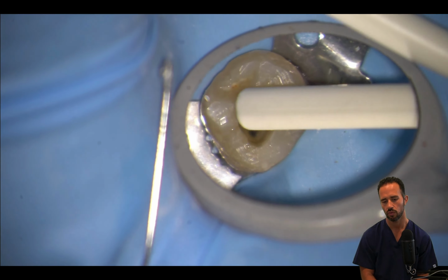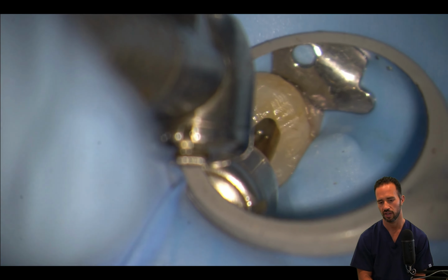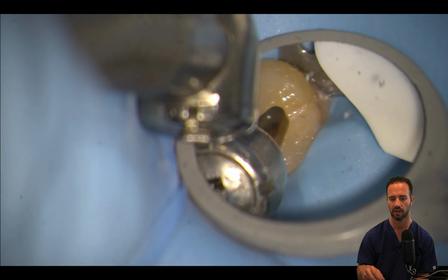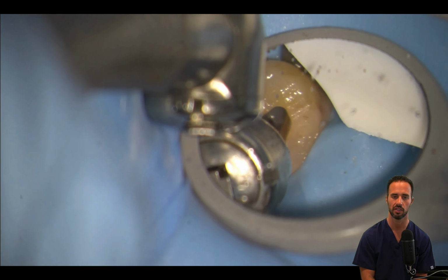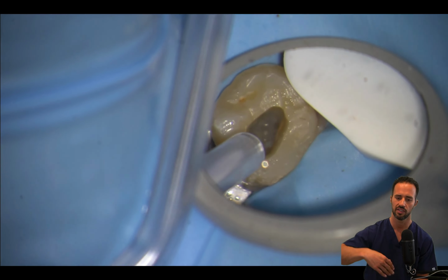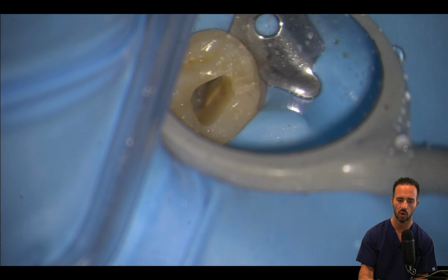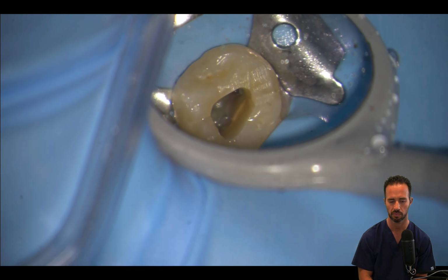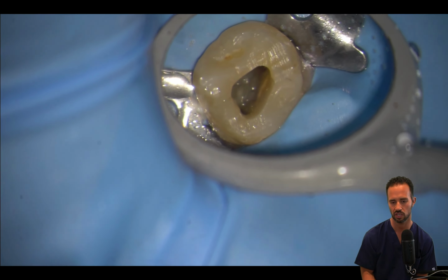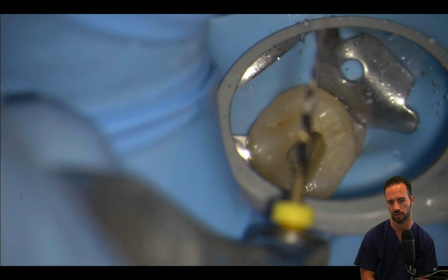Now, when you use your high-speed round burr to penetrate down into where the MB2 should be, you don't really want to prepare in an apical fashion because you can perforate the case. So you're almost preparing laterally to continue to unroof any potential dentin bridge over where that MB2 should be. So it's very, very mild apical preparation, more lateral preparation or mesial preparation, right?